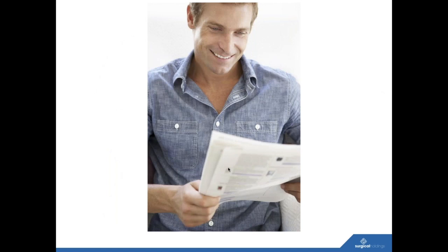And you might not be as happy as this guy, but obviously read the IFUs. He seems to be very happily reading the IFU, and I know that's an IFU because when I put it in Adobe Stock, that's the image that popped up. So he seems to be very happy about it. I'm sure that's not always the case when you're reading pages and pages of IFUs, but certainly just to pick up points around any delicate materials that could be accidentally damaged by any higher pH chemistries, or just any considerations around washing and drying. And obviously, you should always thoroughly read the IFU.